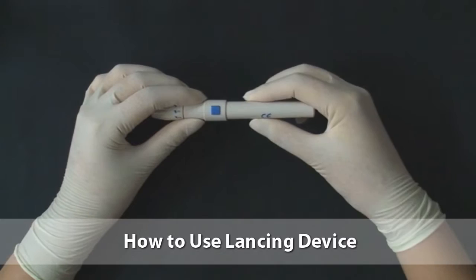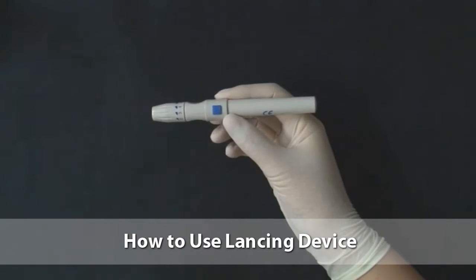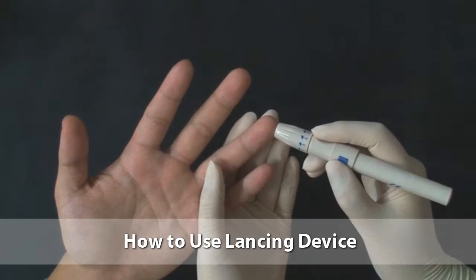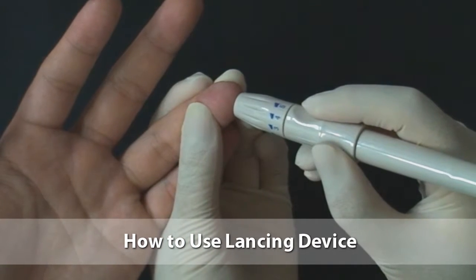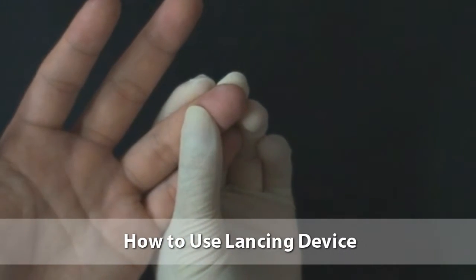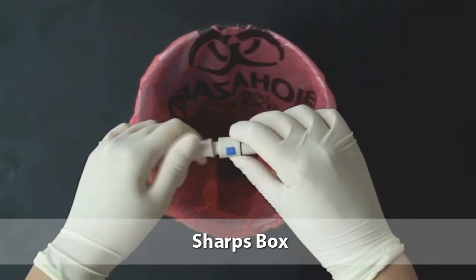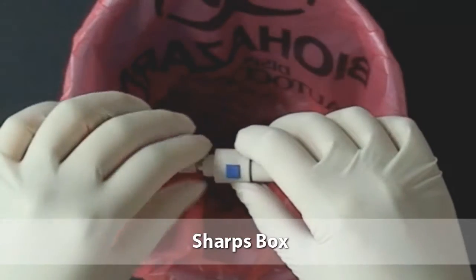Pull out the lancing device body as far as it will go and then release it. It makes the lancet ready to prick. Push the blue button on the lancing device. The lancet inside will prick the patient's finger. Discard the lancet immediately after pricking the finger.